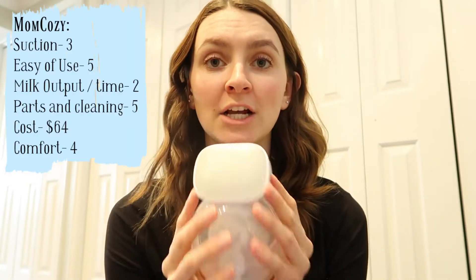The first pump I want to talk about is the Mom Cozy. You've probably seen this everywhere. If you want to watch my full review on the Mom Cozy, you can go check it out. Here I'll talk about key points and give them numbers. My categories are: suction, ease of use, milk output and time, parts and cleaning, cost, and comfort.